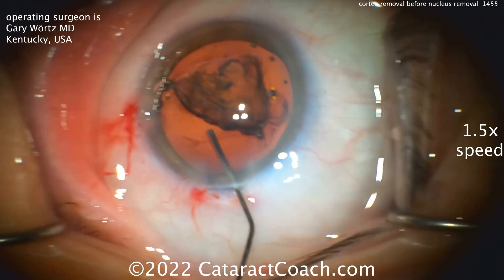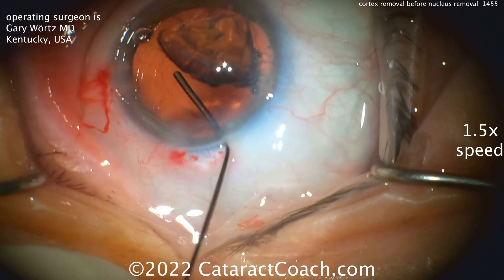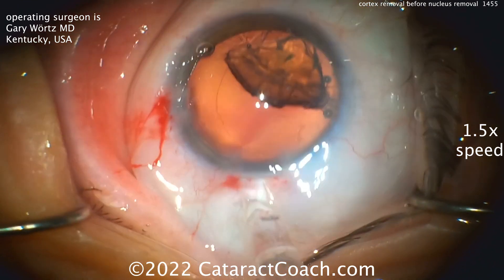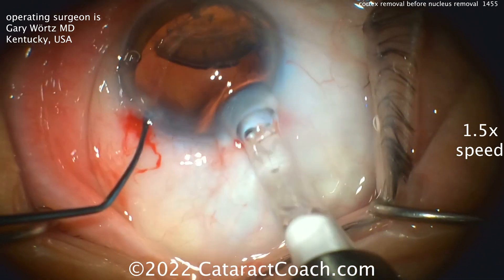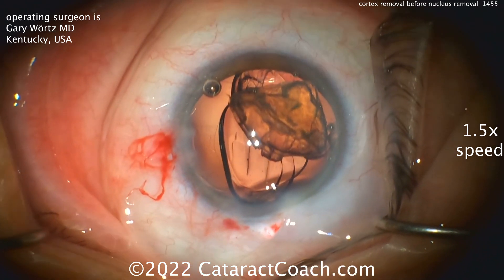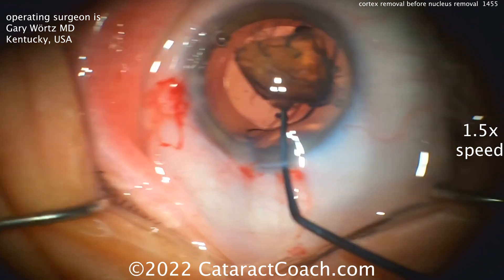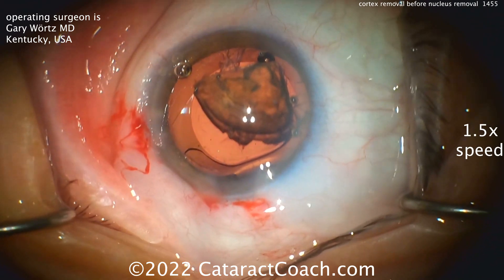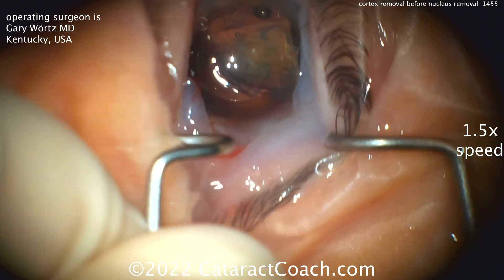Here comes the viscoelastic, filling up the capsular bag — not worrying about that last big quadrant; that'll come out later. Then getting the IOL into the capsular bag. I'm sharing this video because this is something I've not seen in 25 years. I've never seen this before, but I get it. I understand why he did it — it makes sense. And I like the video. Now look: the capsular bag is being protected by the IOL. Beautifully so.